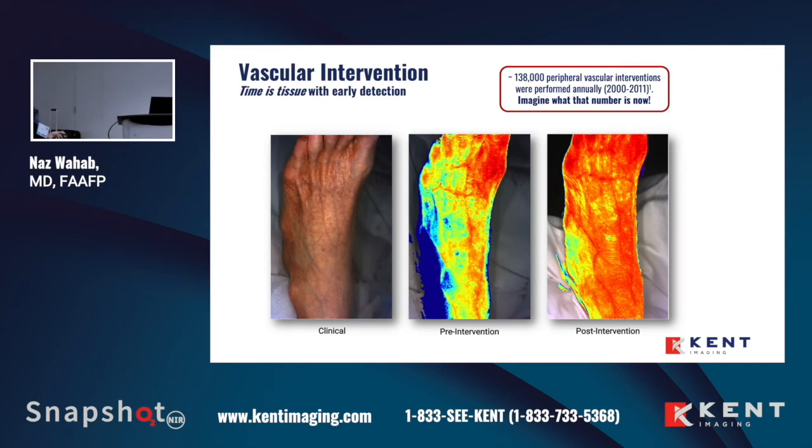Pre-intervention, we can see that there is a significant decrease in oxygenation here. I caution those of you who are using the technology for the first time and only looking at colors. I do think that the colors can be somewhat deceiving. And so actually putting your fingers or a stylus on the touch screen to check the areas of oxygenation is very, very important. It's important to also check the surrounding tissues as well, and to really get an average of the entire area.